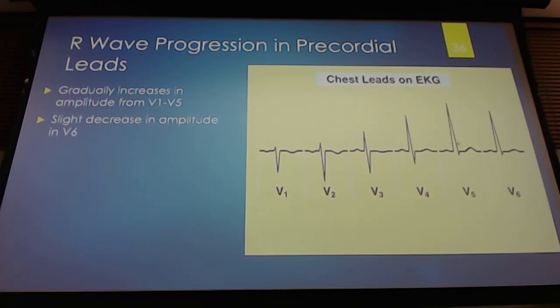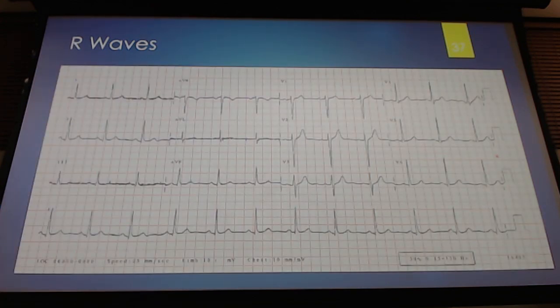But look at that S wave, hardly any S wave here or here. We can look through this ECG and just see the differences in the amplitudes from lead to lead to lead. And there's no lead pair where you can say, oh yeah, 1 and 2 should be the exact same, 2 and 3 should be the exact same, 2, 3, and aVF should be the exact same because they look at the inferior portion.